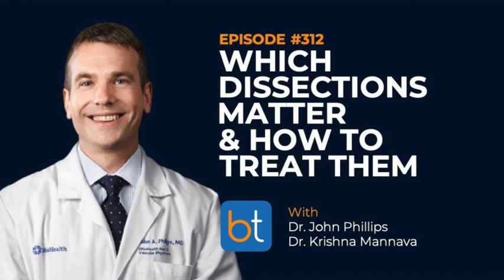And then after it, I try to assess the blood flow in that vessel. I make some assumptions when I'm treating a tibial vessel that I don't have any significant lesions or problems with inflow. So my iliacs are clean, my SFA, my pop is clean. And so in my mind, I feel like after I've opened up whatever vessel it is, I should get a good signal in that foot or maybe even feel the pulse.